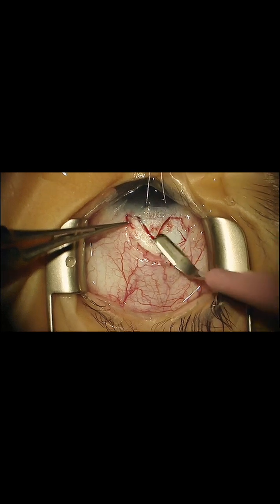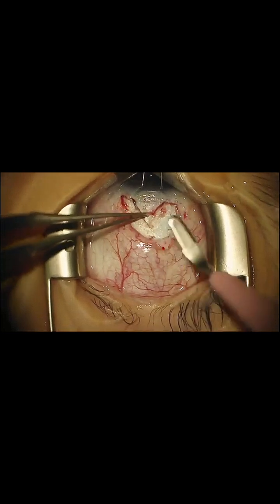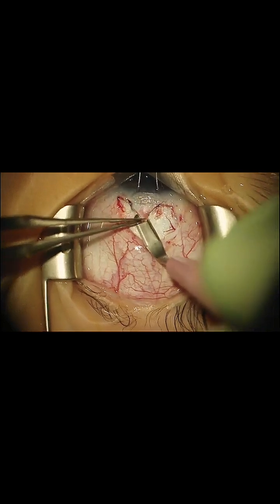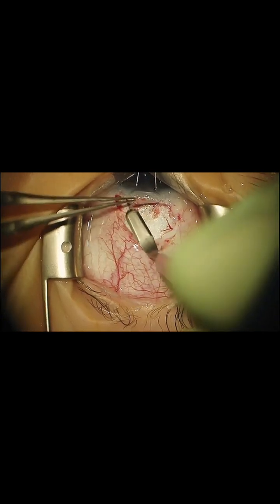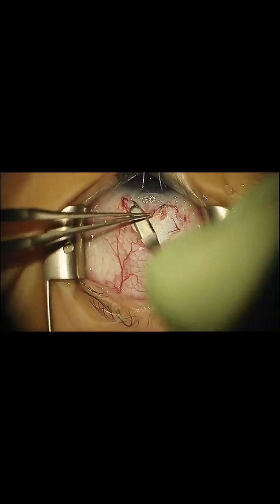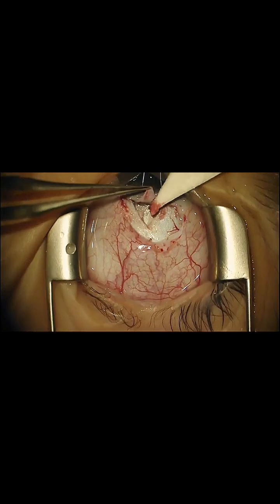I'm aiming for half depth. Of course, you don't want it too thin, but you also don't want this to be too thick. But again, keep in mind, this is a buphthalmic eye. The corneal diameter is 14 millimeters. So what might be normal depth in an adult is going to be less in this patient, or actually it's going to be deeper, because this sclera is just thinner. It's been stretched out. What we want to get to is kind of the blue-white junction.